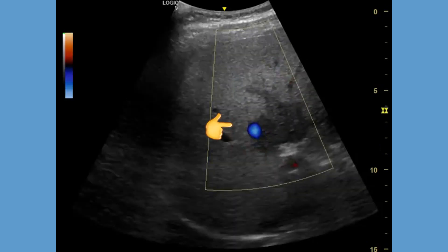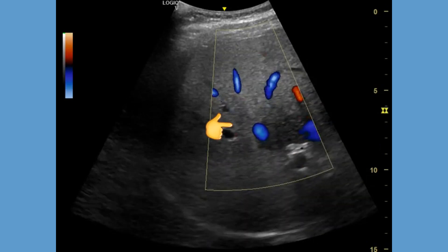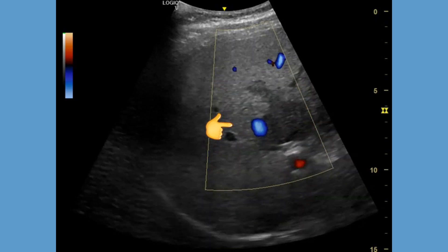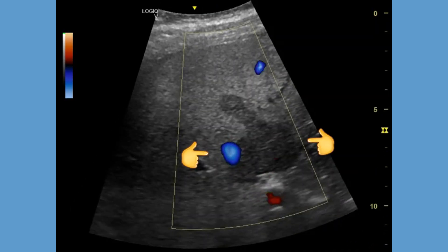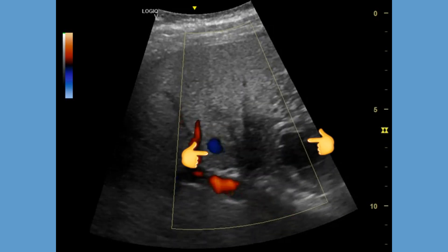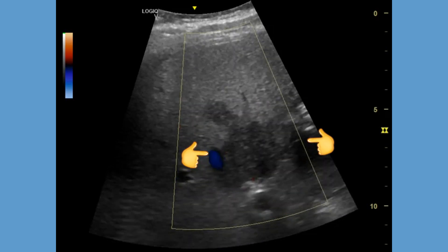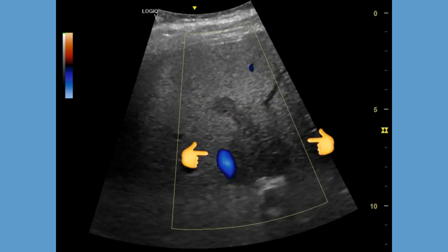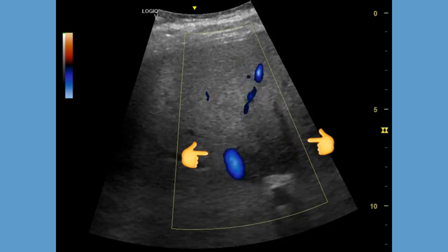focal fatty sparing represents a localized region where fat accumulation is less pronounced. In this patient, we see a well-defined hypoechoic lesion between the gallbladder fossa and the porta hepatis. This is possibly the commonest site of focal fatty sparing.